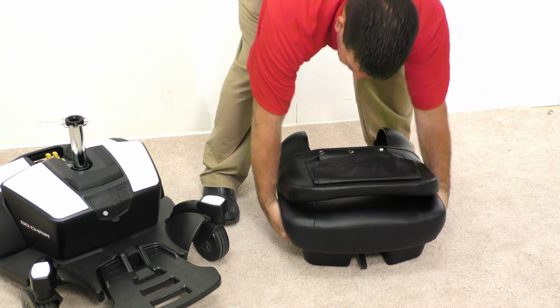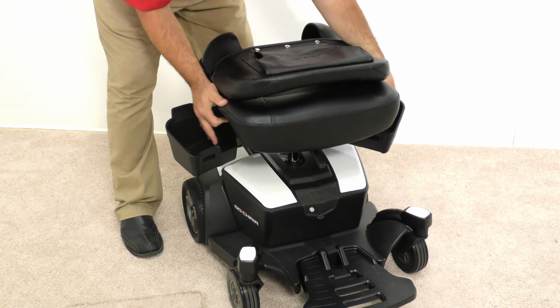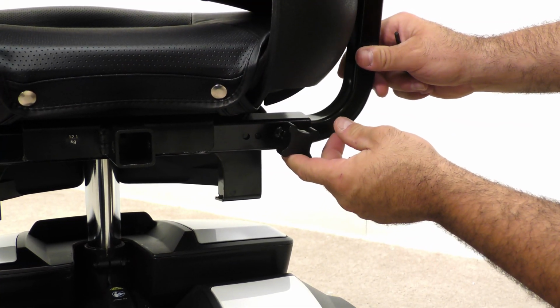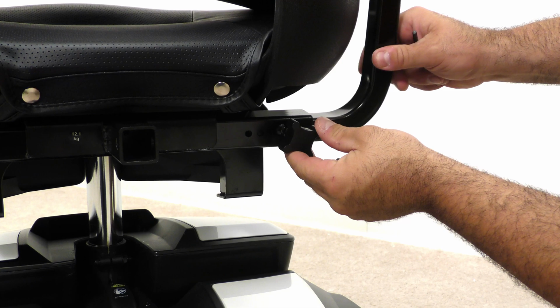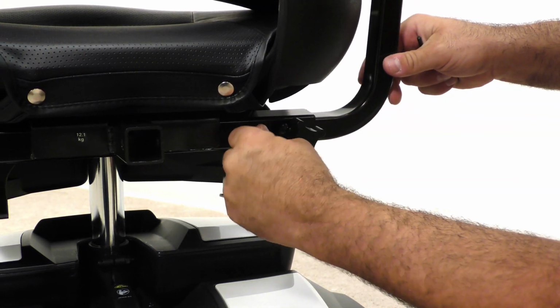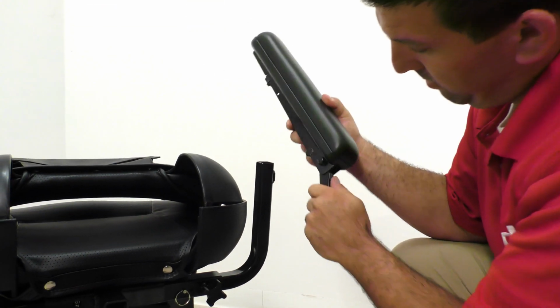Place the seat on the seat post. Make sure the underseat storage is open before placing on the post. Slide the lower half of the armrest in the receiver and set to the desired width by aligning the holes. Use the smaller detent pins and adjustment knobs to tighten. Make sure the nut is on the inside of the armrest.